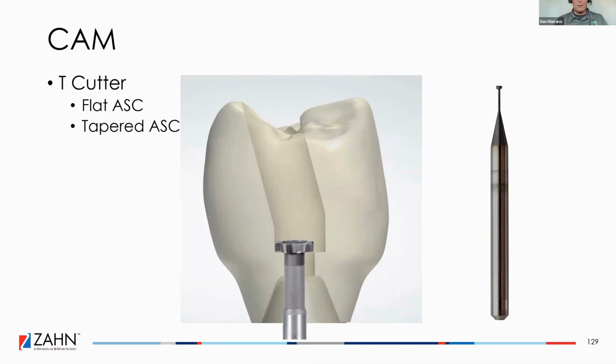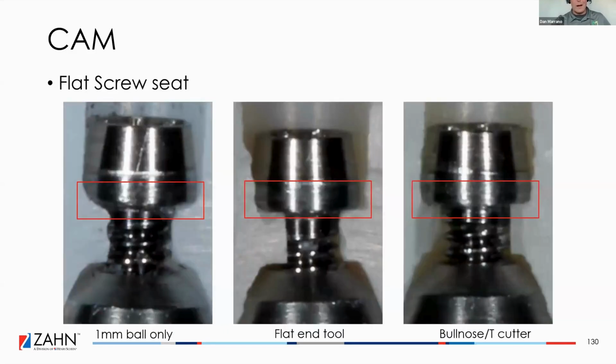Make sure that is milled properly so that the screw seats. We're not dealing with tie bases where maybe you could ream out the hole a little bit by hand or you could punch the access channel out in green state. You can't do that with these cases. You need to make sure that your tooling and your manufacturing is spot on.